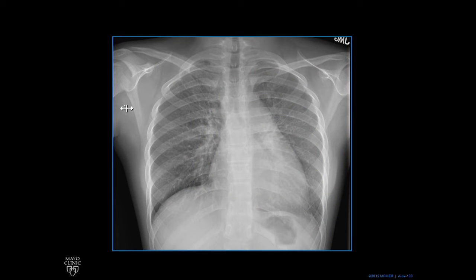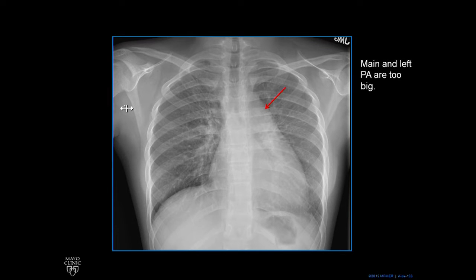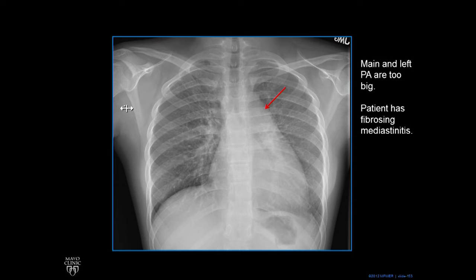Here is this patient — this is abnormal. We had this patient come up previously. This is a person with pulmonary hypertension from fibrosing mediastinitis. We see that this bump in that region is too big. You can see that the left main bronchus is sort of bowed down, displaced down. The main and the left pulmonary artery are too big. This patient has fibrosing mediastinitis — it causes fibrous tissue to build up around the vessels. In this case, this person had a lot of their peripheral pulmonary arteries narrowed, which caused their main pulmonary artery to get big. It also had pulmonary vein obstruction, which will come up later.